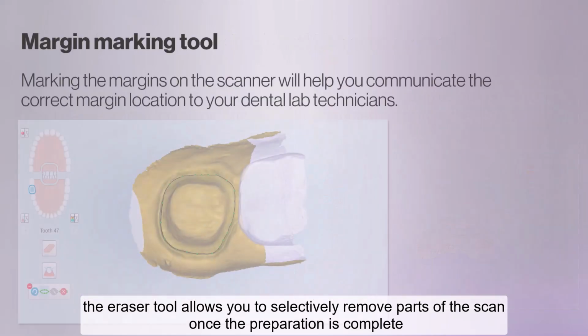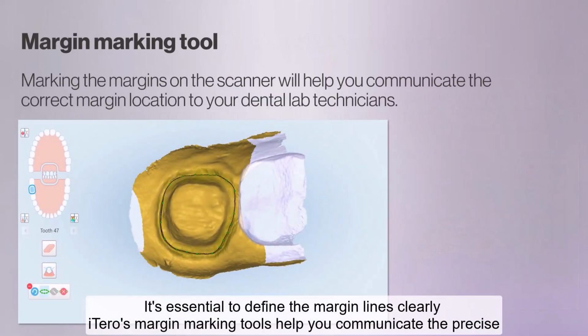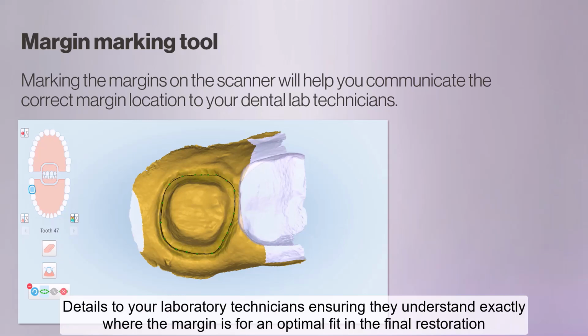Once the preparation is complete, it's essential to define the margin lines clearly. iTero's margin marking tools help you communicate the precise details to your laboratory technicians, ensuring they understand exactly where the margin is for an optimal fit in the final restoration.